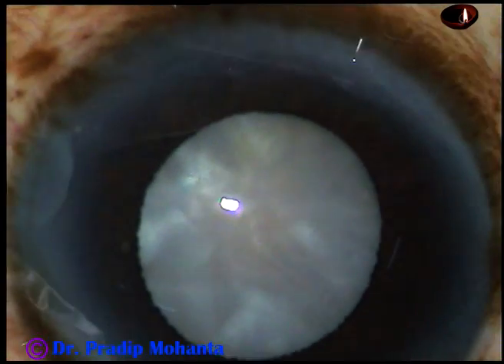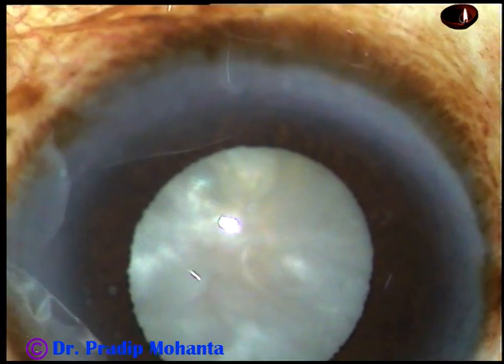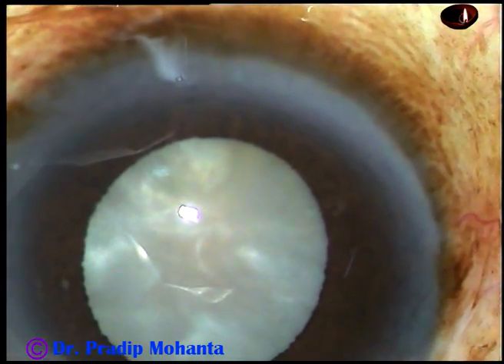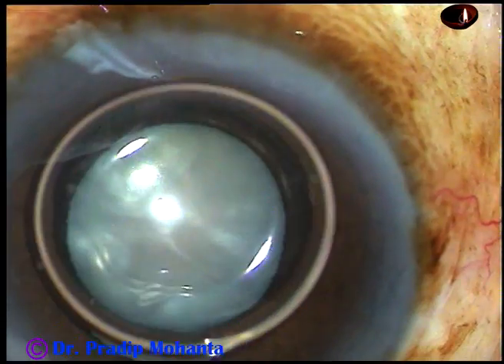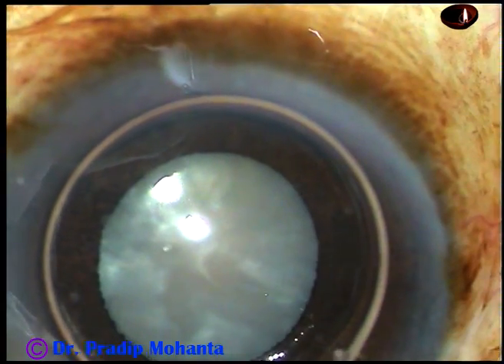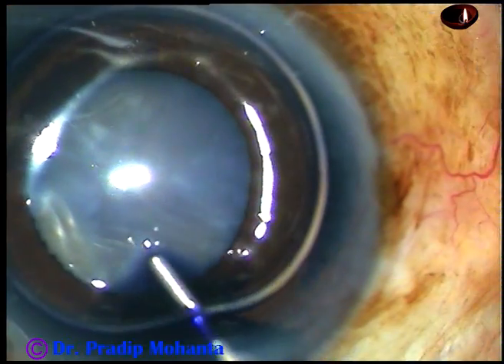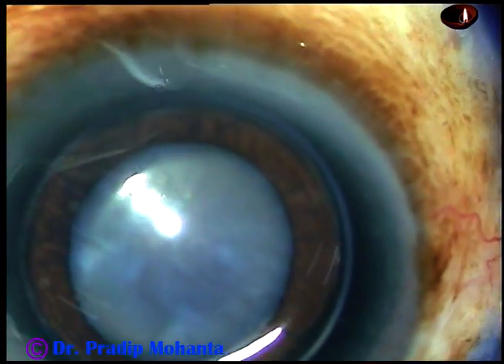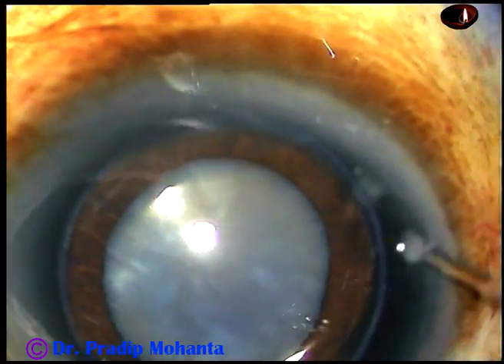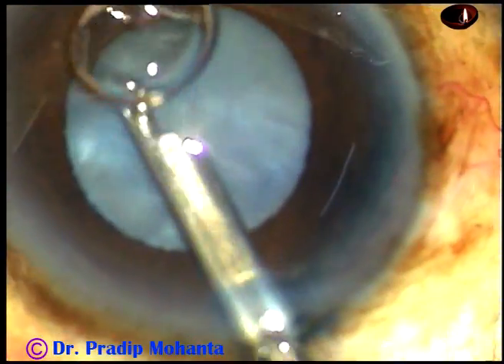By this time, the main incision has been made and two side ports have been completed. Now I want to stain the anterior capsule of this mature cataract with trypan blue dye. And here goes the dye. The dye should touch all parts of the anterior capsule, and I prefer to stain the anterior capsule underneath an air bubble. The dye is now washed out.